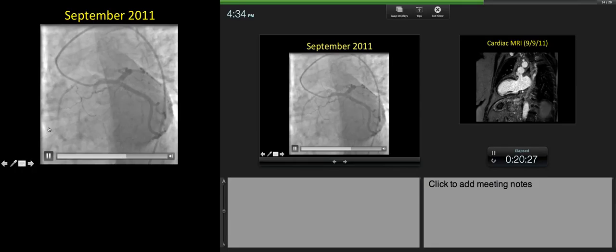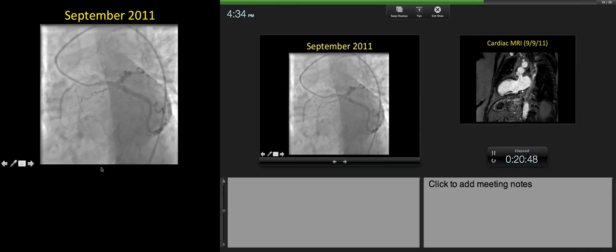Better than before, where the stent is, there is no catheter, then the contrast that starts filling the distal right coronary artery 1 centimeter from the ostium of the left main. There is not even a cul-de-sac of the right coronary. It has completely obliterated the proximal right coronary.